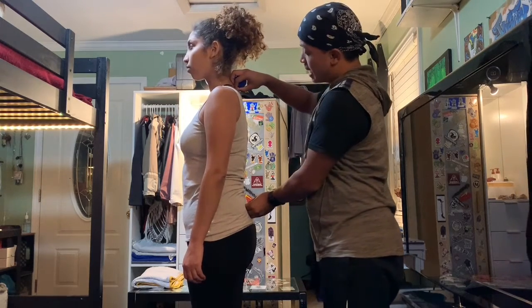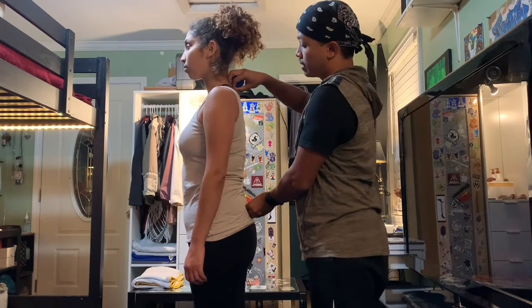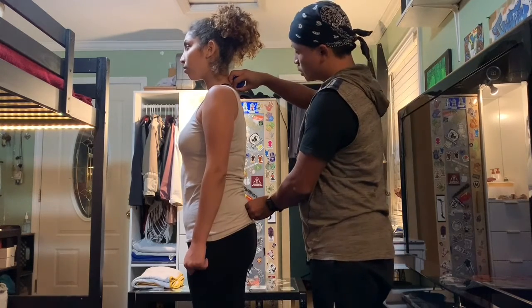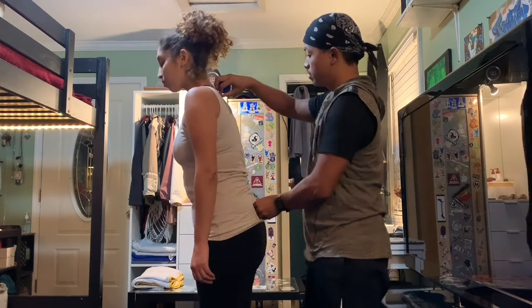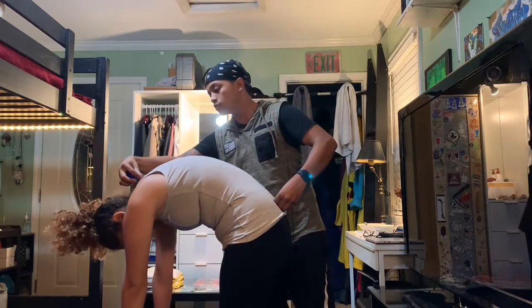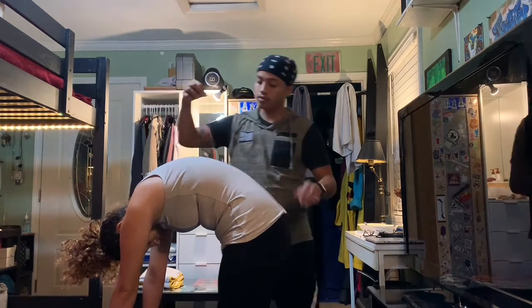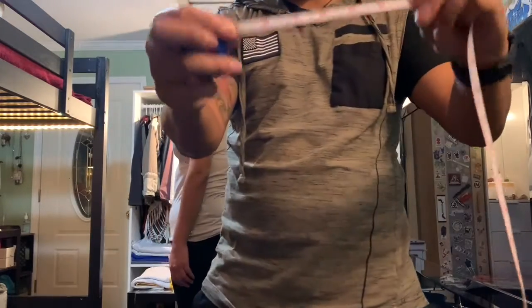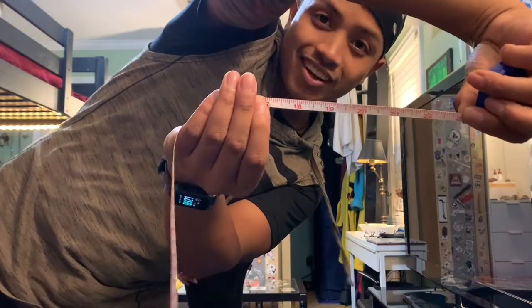I am now going to have her stabilize her feet and reach forward and flex her hip and trunk. She's going to bend forward, reaching towards the ground. Go ahead and bend. This will elongate her spine and provide a new measurement. She started at 17 and now is at 23.